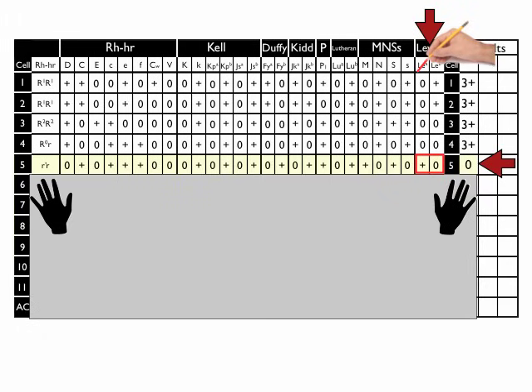Let's move on to the next pair, which is the big S and little s pair. And we do the same thing. We see that big S has a double dose. There's no reaction. So again, pen comes over, write a single slash through the big S. So easy, no problem. Those slashes indicate a double dose rule out. You go along, you do the same thing with M and N. Again, in this case, you see that the M has a double dose rule out. You go along, you do the rest of the panel exactly the same.